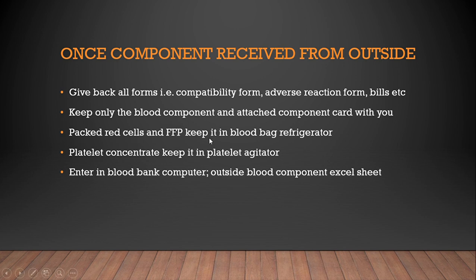Packed cells and FFP: since this FFP will be already thawed, you need not keep it at -40, so you can keep it in the blood bag refrigerator only. Packed cells will obviously go there. If a platelet has come, then you have to keep it in the platelet agitator only.